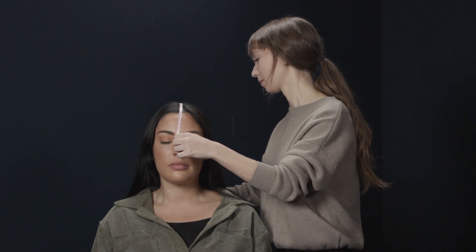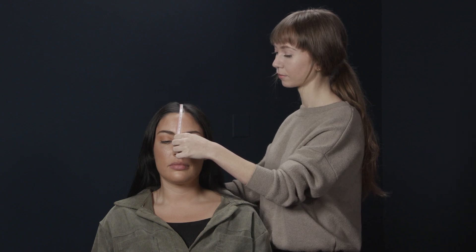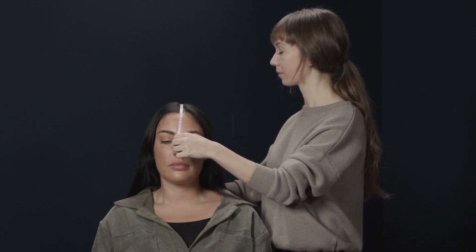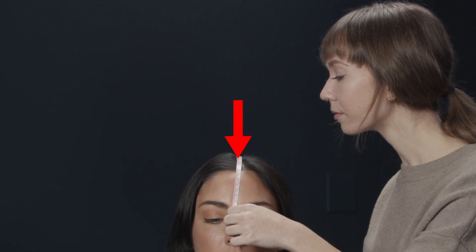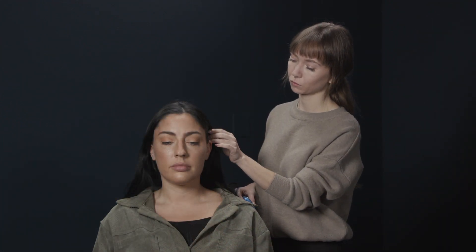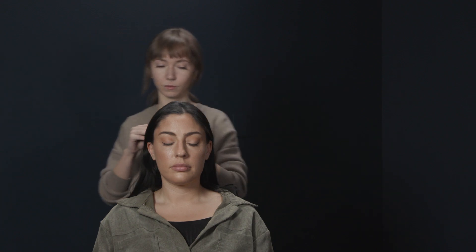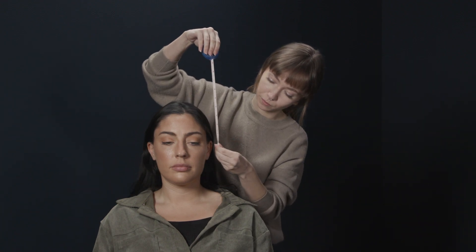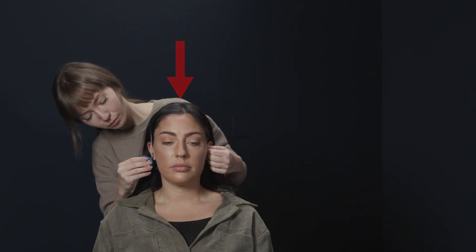Pull the tape tautly, especially if the subject has a lot of hair. Failure to do so will give you a false measurement, potentially leading to an incorrect strip size. Make note of the center point of this measurement, as you will use that center spot in the next measurement. Record the value. Next, measure laterally from the top of ear attachment on one side of the head to the top of ear attachment on the other side, running the tape over the center point from the previous measurement. Record the value.